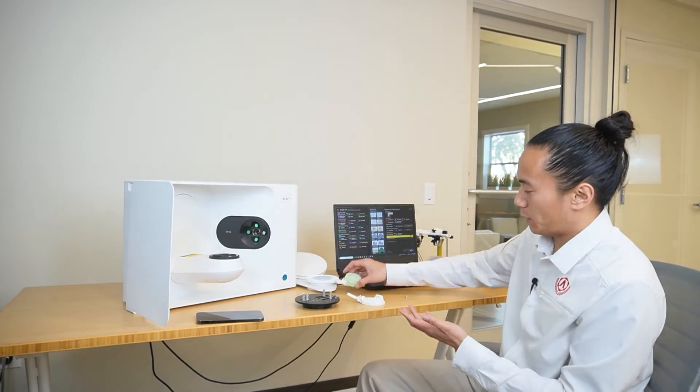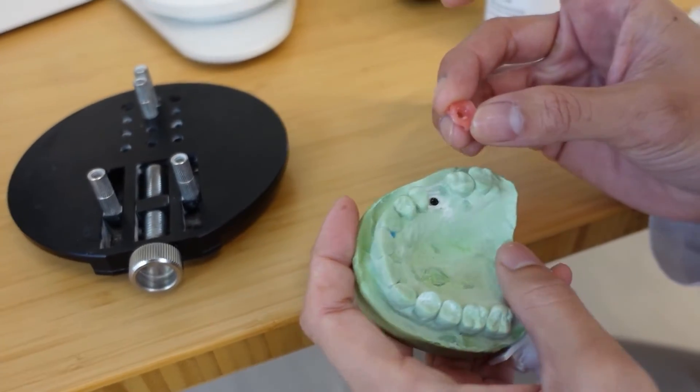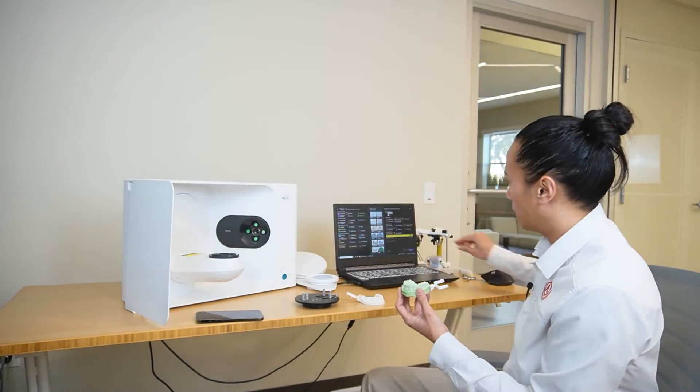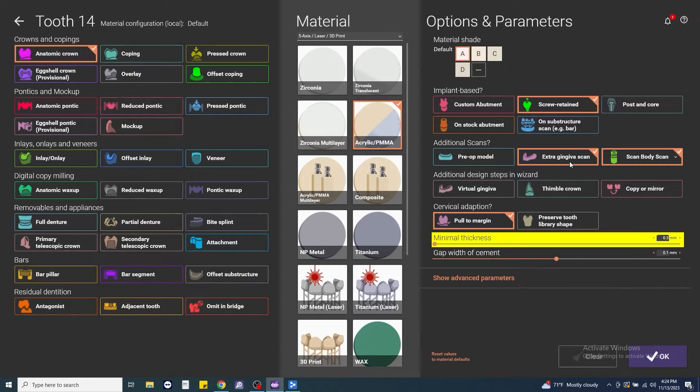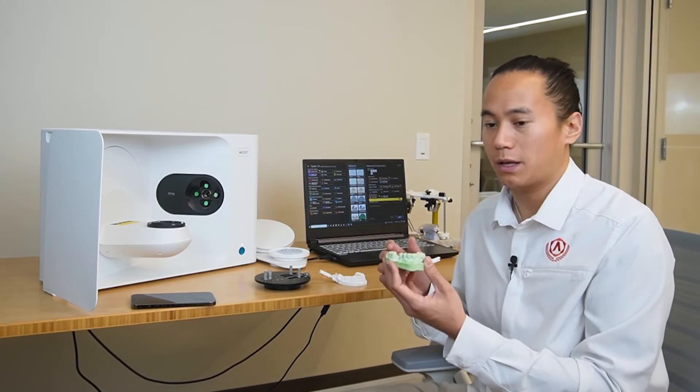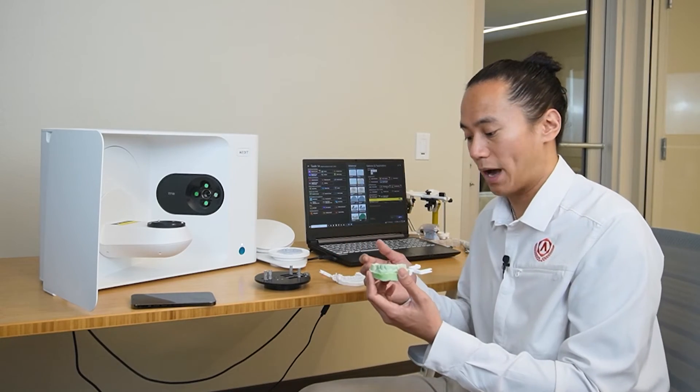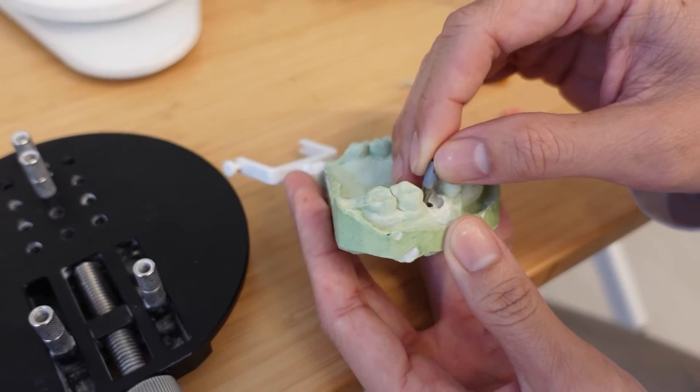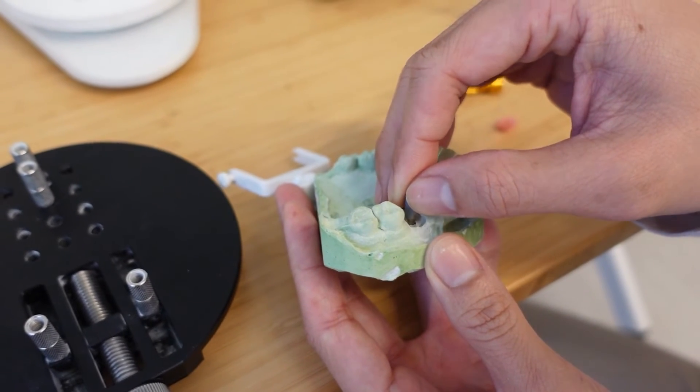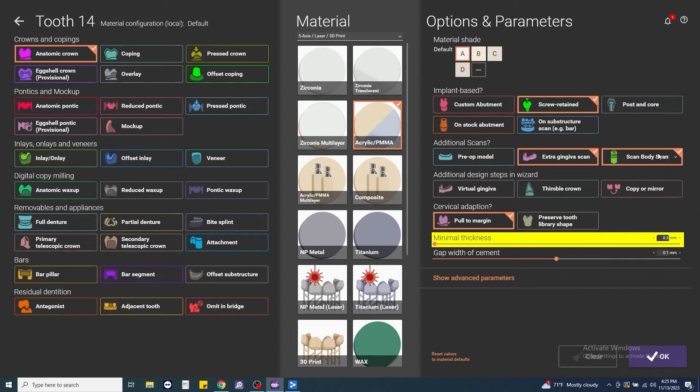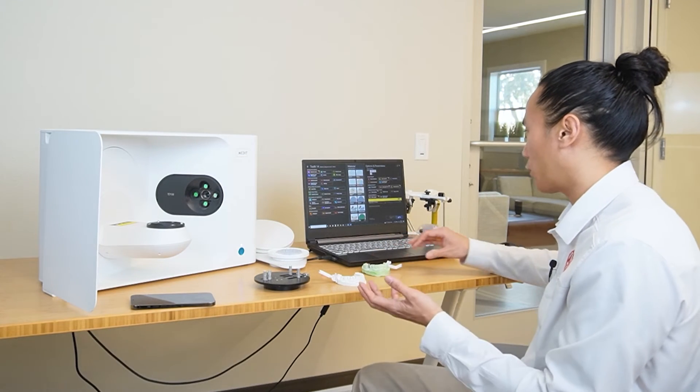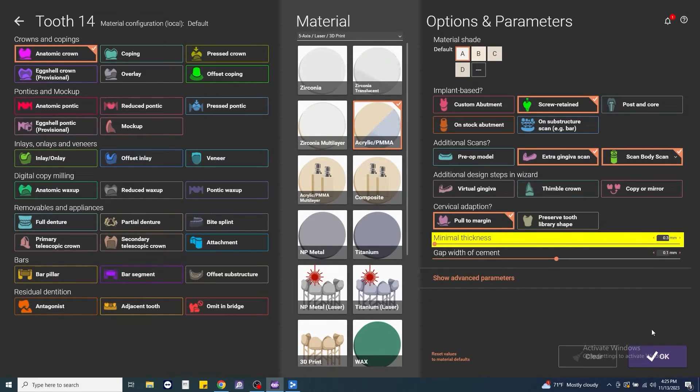Under additional scans, this is where it's going to be important. If we have a removable gingiva like this, we want to include that in the initial setup. So under additional scans, we're going to select extra gingiva scan. If we had a pre-op that the client has waxed up or that we've waxed up, we can include that here as a pre-op. Under scan body scan, we have a few different options. Because we're able to scan the model and the model with the scan body separately, we're going to make sure that we have the scan body scan option selected here. We're not doing a virtual gingiva or thimble crown. We're not going to copy mirror anything. So from there, we'll just click OK.